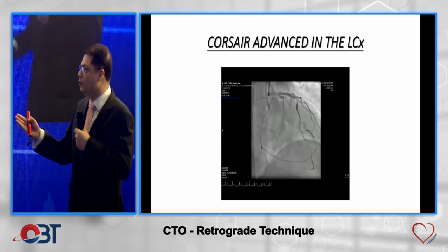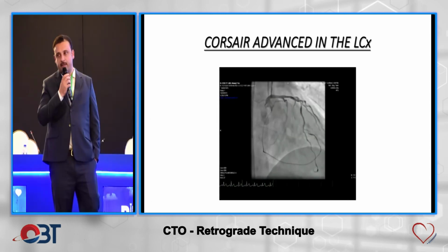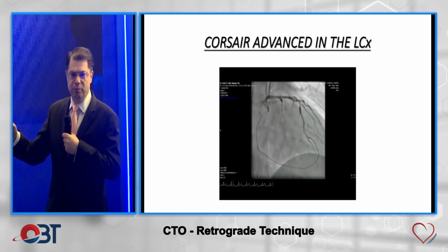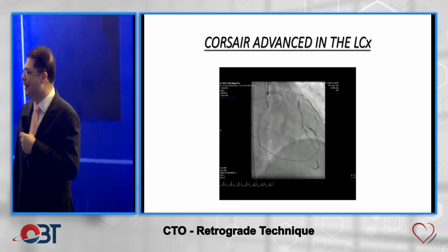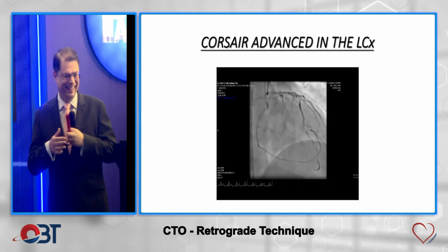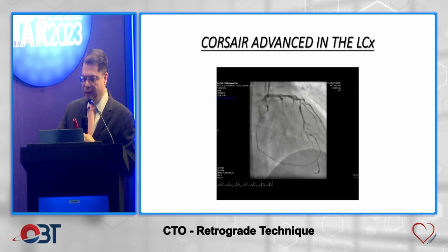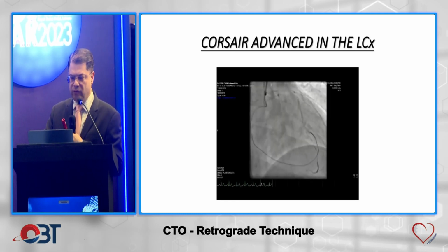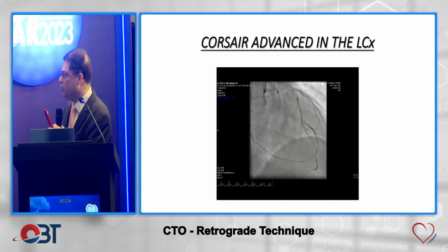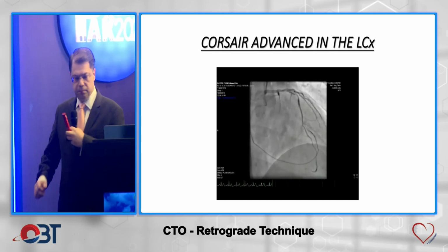And Dr. Alam has... for transverse collaterals, specifically epicardial, this is the best wire, the SUOH 3. But he has to tell us where he gets it from. He doesn't tell us that. It is confidential. So we don't have a SUOH 3 wire. Ideally, in an epicardial collateral, it should be a SUOH 3 wire, which is probably the safest because perforation in an epicardial collateral can be catastrophic.